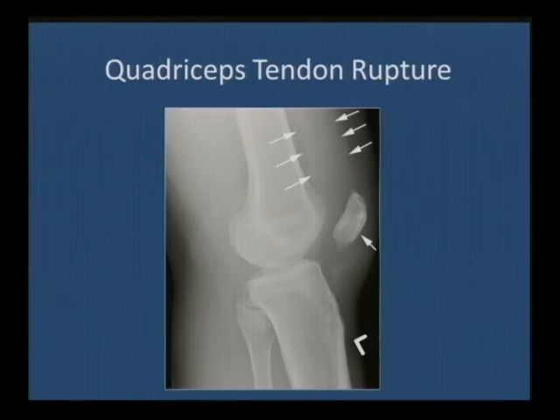And it's very important, as I mentioned before, to interrogate the radiographs on all these patients. Unfortunately, we don't always have radiographs when the patients are sent in from another institution and turn up for an ultrasound of the quadriceps tendon, but most times we do have radiographs. If you have radiographs, you should always look at them carefully.